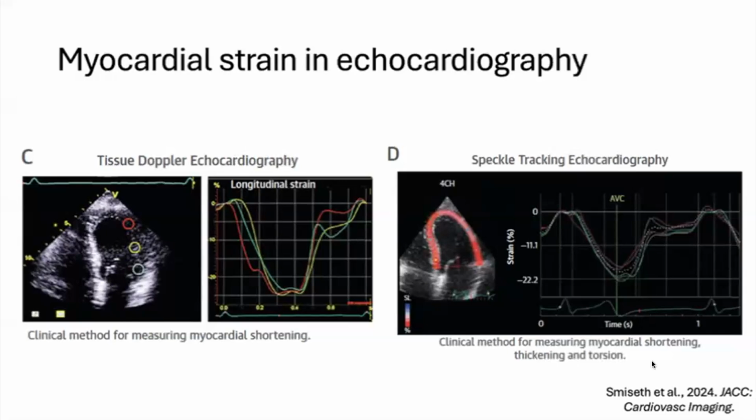And then just one more thing about speckle tracking and strain analysis for the LV: we usually refer to things in absolute numbers. But as you may recall, we're often dealing with negative numbers, because of the mathematics behind the strain analysis and the fact that the distance between the tracked speckles is actually shortening when the cardiac chamber is contracted.